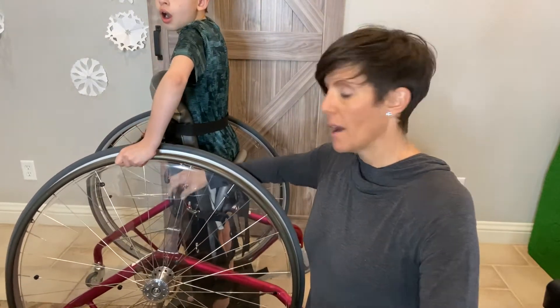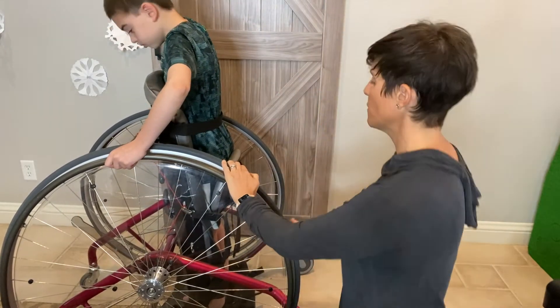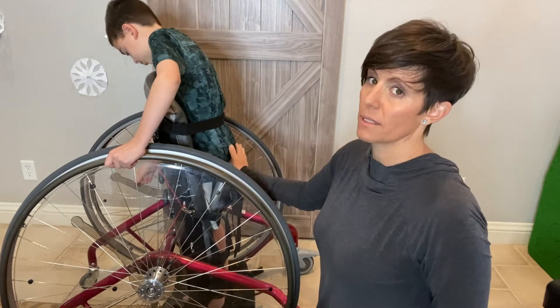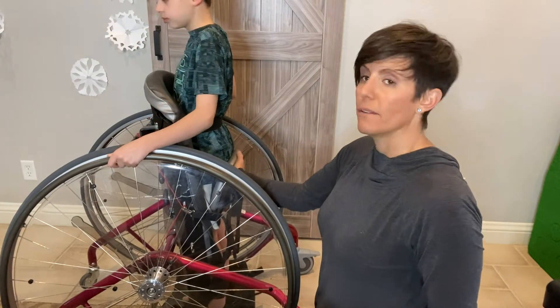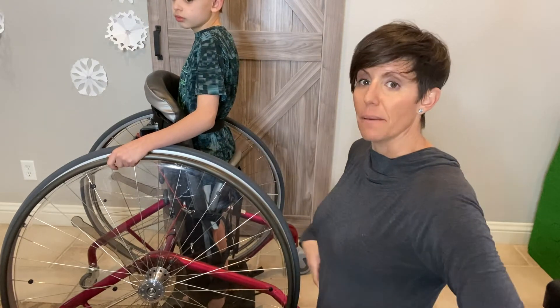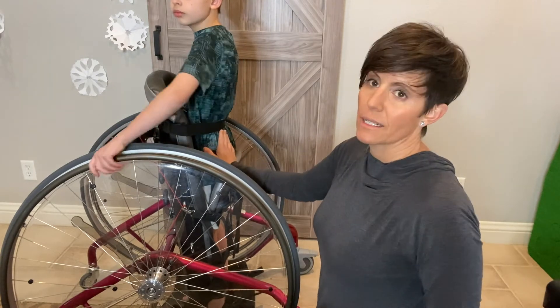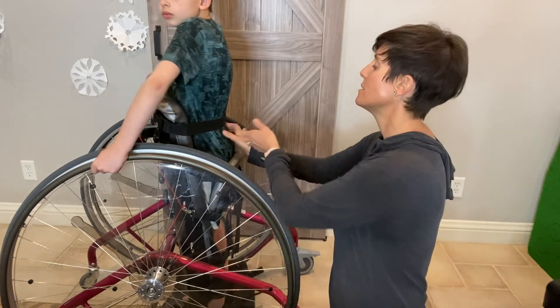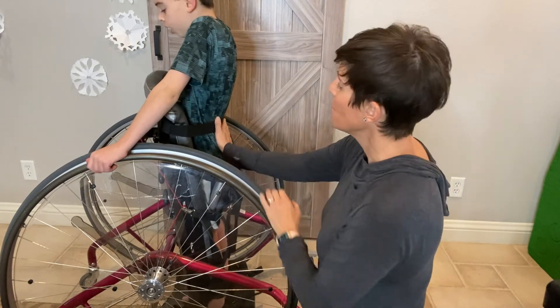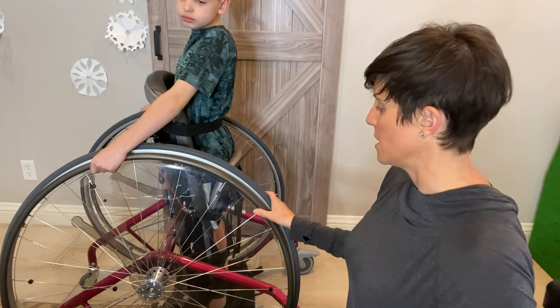When you're transferring somebody out, you're going to want to lock those brakes and then do everything in reverse — go bottom to top. Sometimes if you have a child that's really weak and can't stand up on their own, you might want to leave the bum pad on longer. A padded gait belt is a helpful tool for this transfer because you can safely have something to hold on to, and the gait belt will not interfere at all with the mobile stander or their mobility in it.